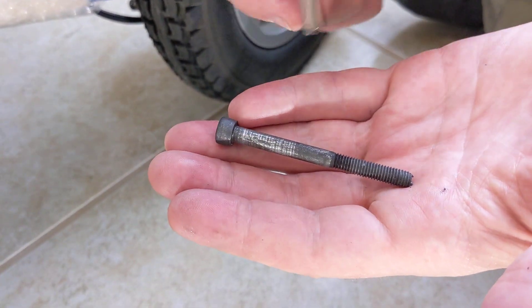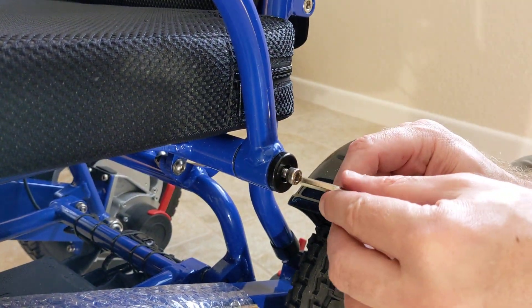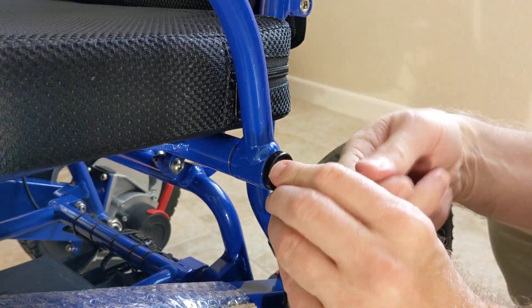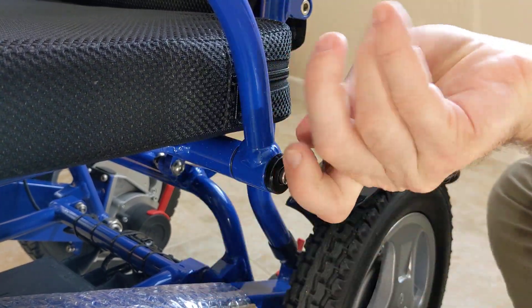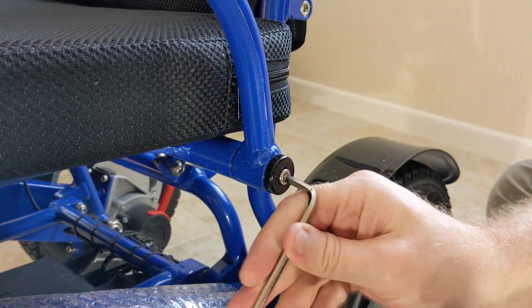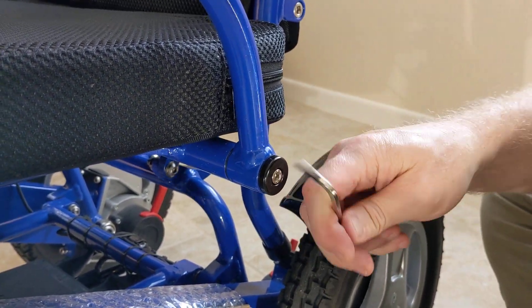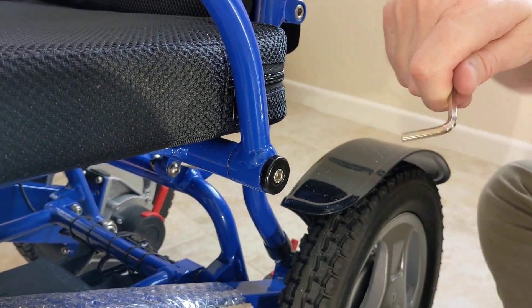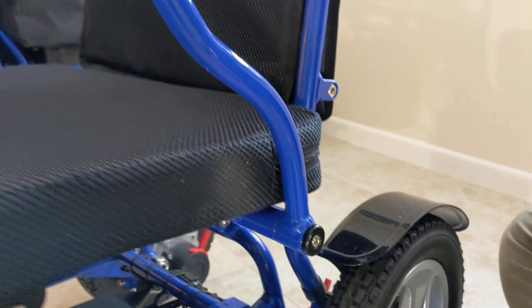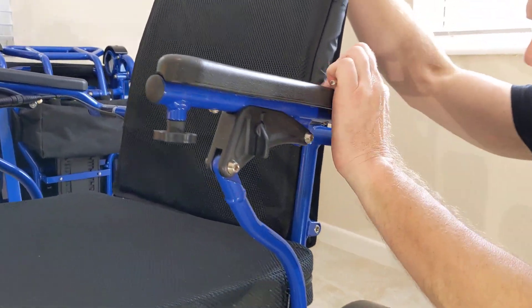I just want to point something out. Before I put this screw back in, I would want to use oil and lubricate the screw itself to minimize any metal filings from attachment and reattachment. If you're going to attach and detach these on a fairly consistent basis, you don't want to strip the actual threads. I didn't make this so tight that I'm jamming it, but tight enough where there's really no play in the actual chair.